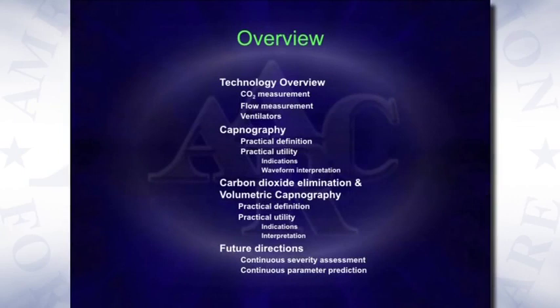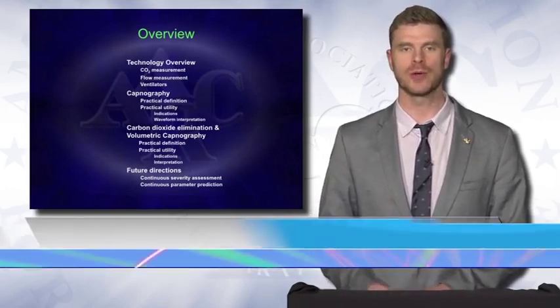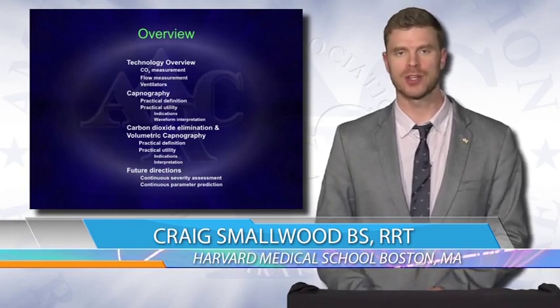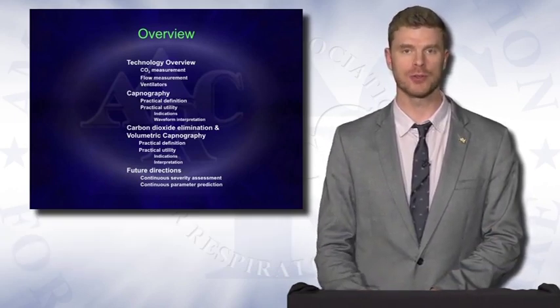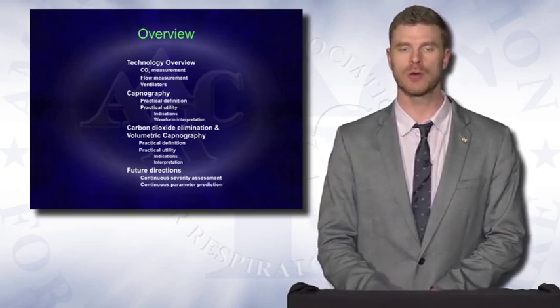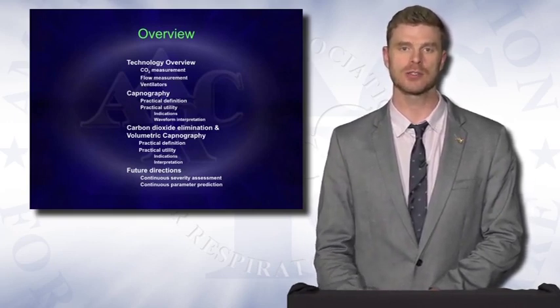So we've looked at technology, we've looked at my 4 favorite abnormal capnograms, and now we're going to get into carbon dioxide elimination and volumetric capnography. Before we move on, I'd like to tell you my real philosophy with monitoring CO2 and identifying abnormal capnographs in your patients. Number one, in very few circumstances can CO2 monitoring tell you definitively whether or not there is a specific pathophysiologic process going on in your patient. Rather, it's corroborative. That is, it can support or perhaps generate hypotheses which can be corroborated by looking to other variables in our patients in specific disease processes.